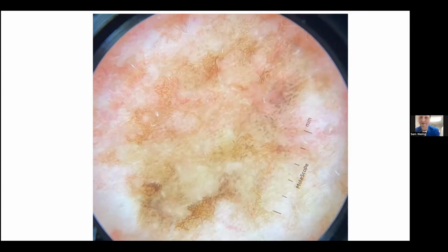Yeah, this is probably not the dermoscopic verbiage, but perhaps in the upper picture, there are some vascular linear structures, but in the lower pole of the picture, there's... I'm not even going to use it. I'm going to stop right there.